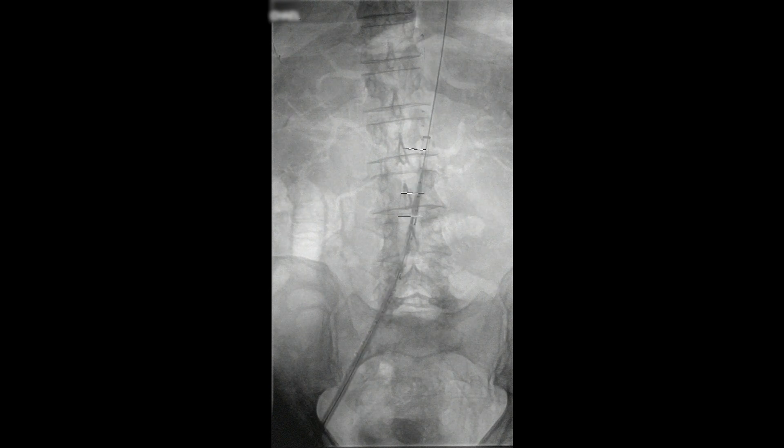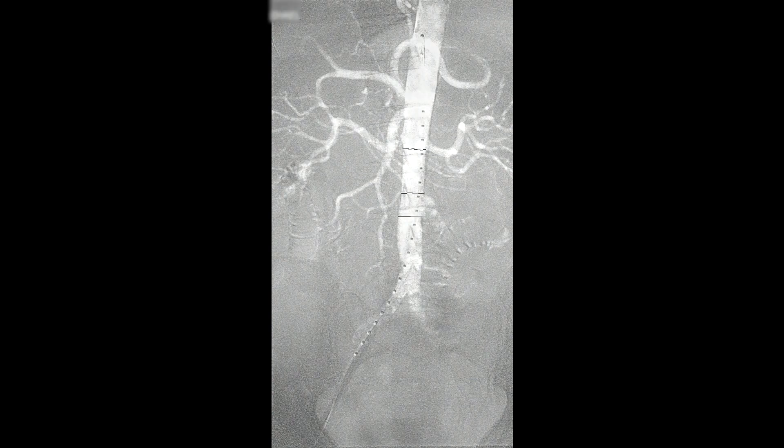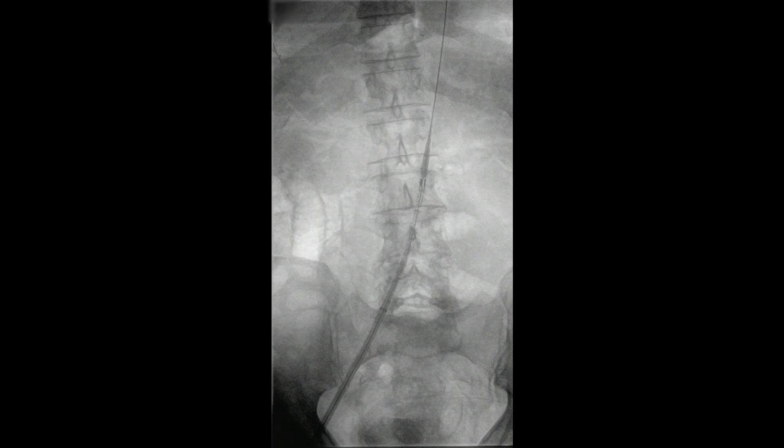Here you can see the cuff is being brought up into position. You can see the fusion marks — not very clearly visible here — but they mark the proximal and distal end of where the aneurysm is. We're going to basically straddle this with the Gore cuff. The Gore cuff in this situation is 4 centimeters long and we chose a 20 millimeter diameter.